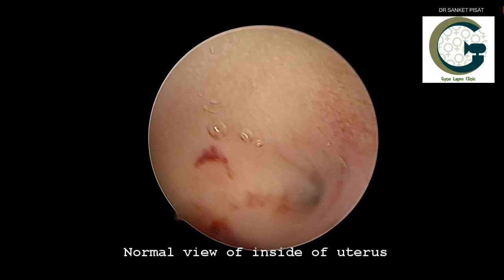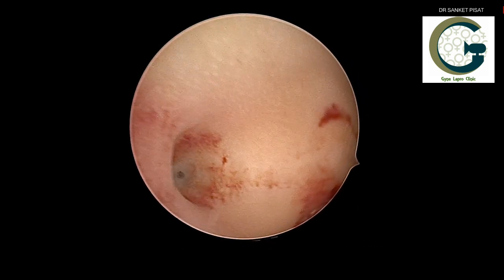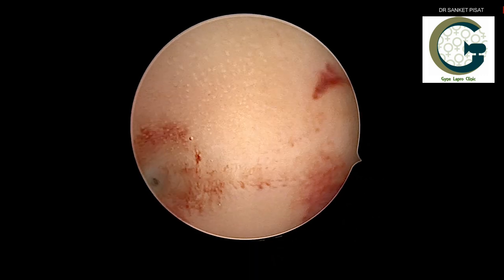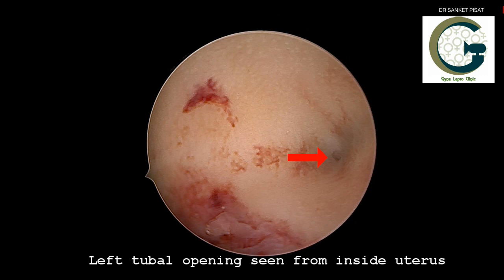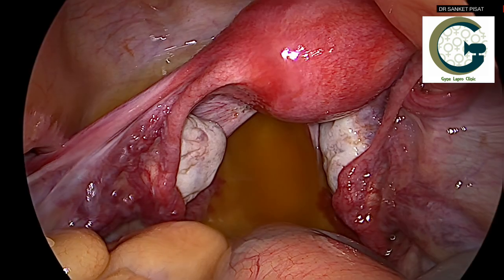This is the normal view of the inside of the uterus, which is a spacious cavity. It has the right tubal opening seen from inside the uterus, and exactly a mirror image of this is the left tubal opening also seen from inside the uterus. This is what the normal uterus looks like — a hollow muscular organ.